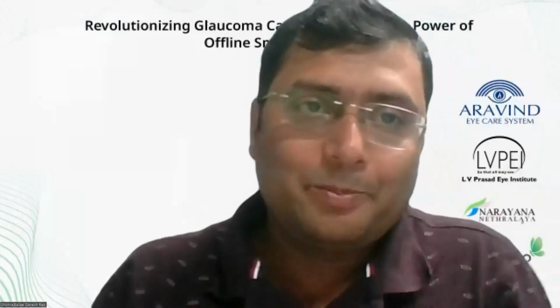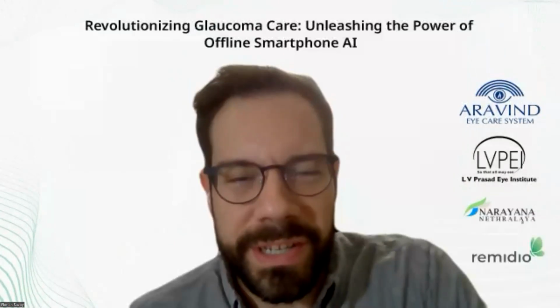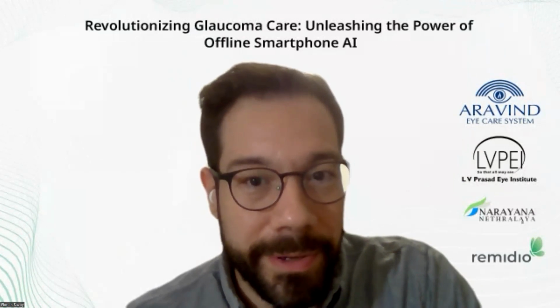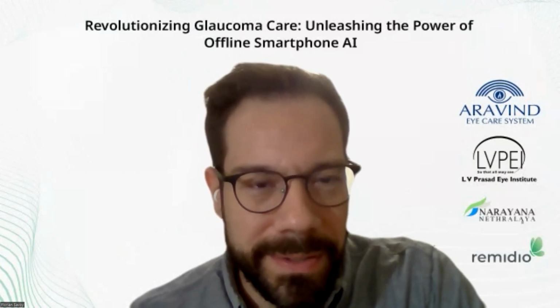Thank you. My next question is to Florin. Florin, we are talking about this offline AI model here. Now, what are the challenges to bring this AI model offline? I think there are two main challenges. The first one: when you start the development of the model, you need to keep in mind that it is going to be deployed on a smartphone. So you need to keep your model size pretty lightweight.